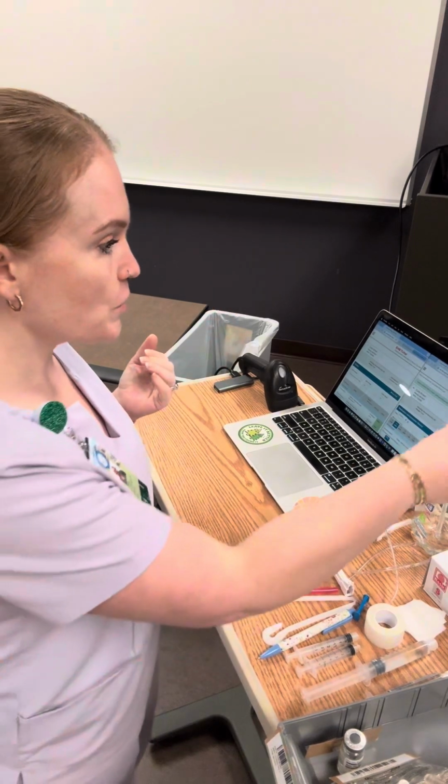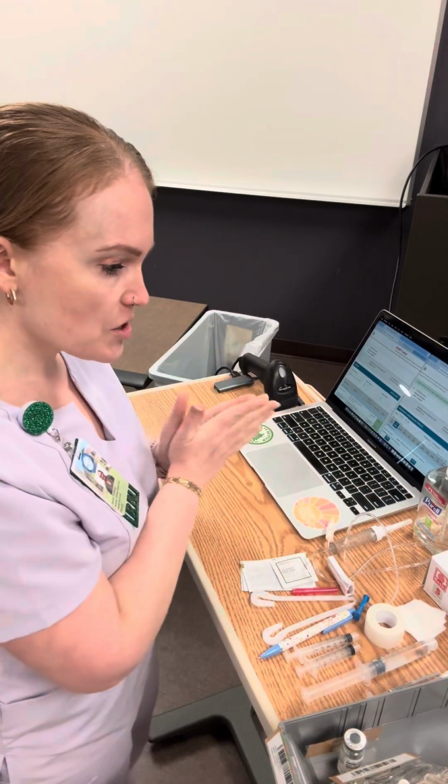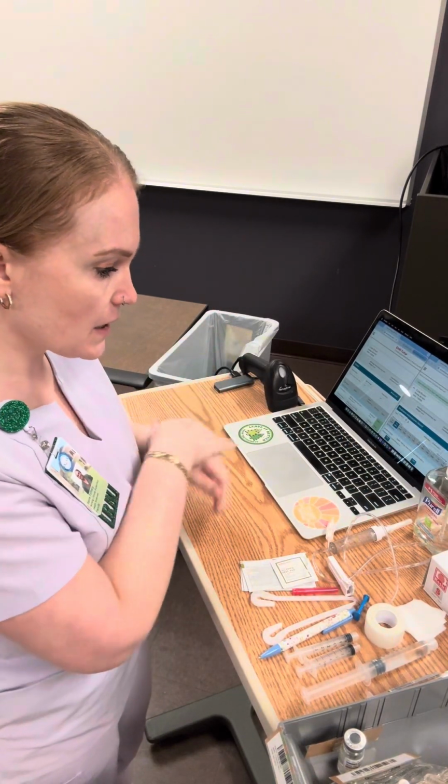We are going to be giving an IV push medication and hanging some IV piggyback medication for our skills verification in this video. So let's get it started. I'm going to first perform hand hygiene. I'm going to ensure that I have all of the equipment that I need for the skills.